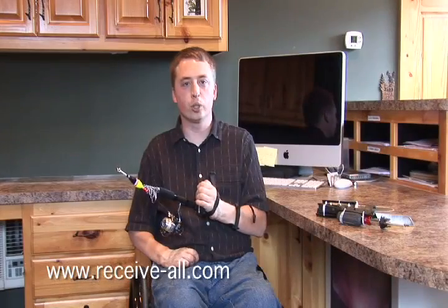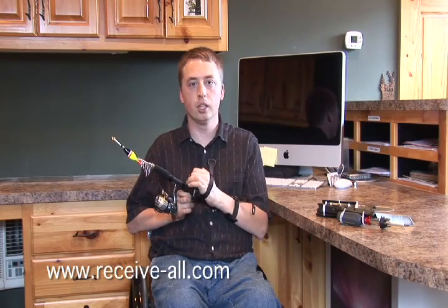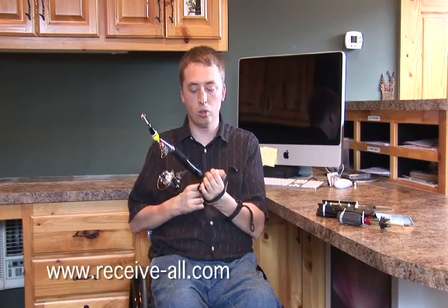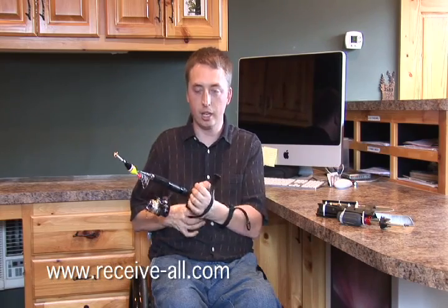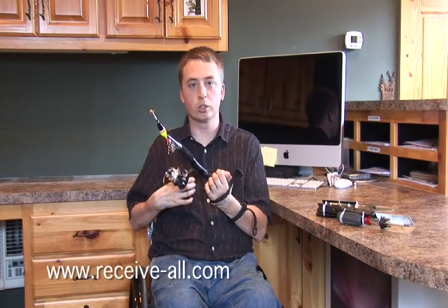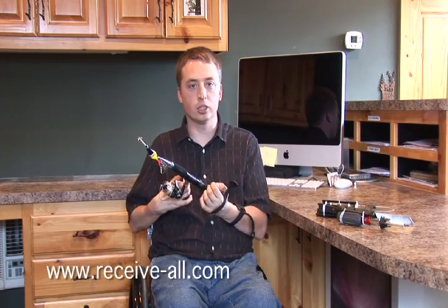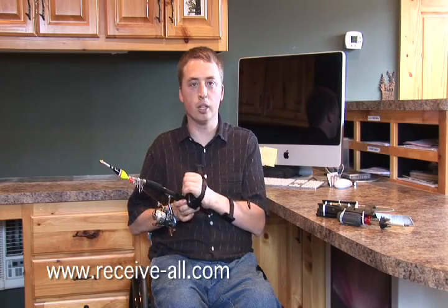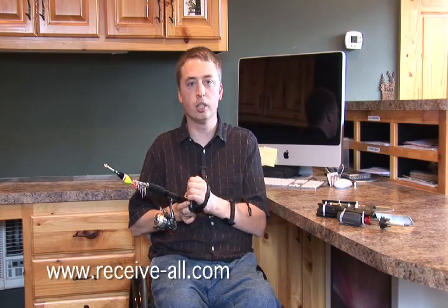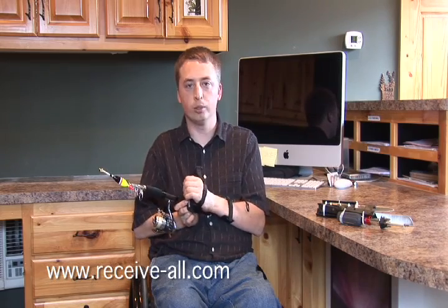Okay, next I'm going to show you the items that I personally use the Receive-All most with. First would be fishing. I'm not able to hold and cast and fight the fish myself, and so with a fishing rod and an adapter attached to the arm brace, I'm able to do all those things myself. Now in this case, we have a telescoping rod, but the person can use an ice fishing rod or a standard fishing rod to put in an adapter and have them ready to go. You can have multiple fishing rods in the boat with adapters on them ready to be used, and a person who would normally not be able to hold a fishing rod, like myself, can use it.